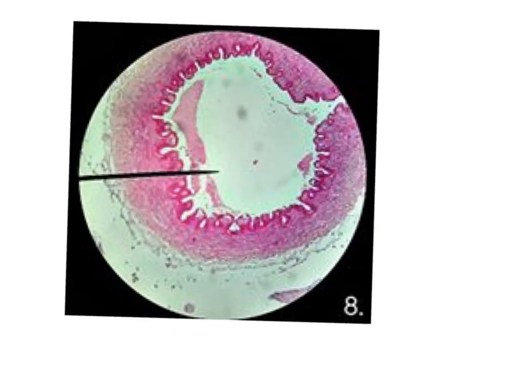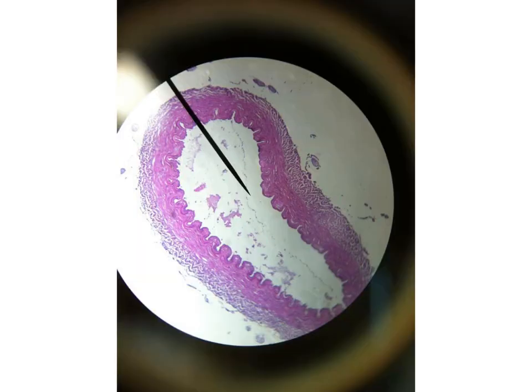Also, this is the basilar artery, thin wall, and it has a very folded elastic lamina. This is also the basilar artery under the microscope, characterized by the presence of this well-developed internal elastic lamina forming a corrugation like this, and the thin media equal to externa.